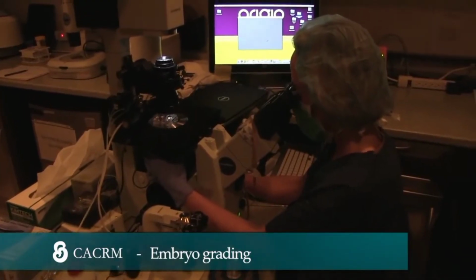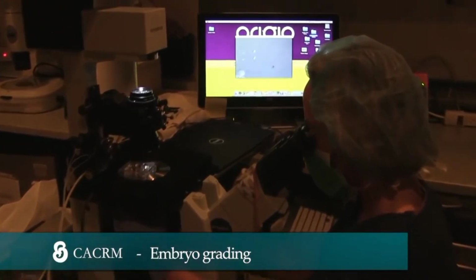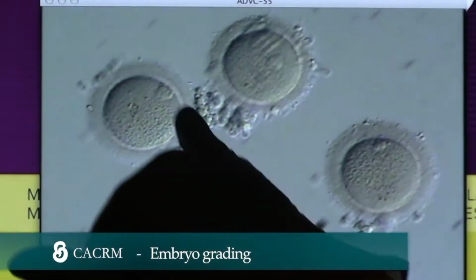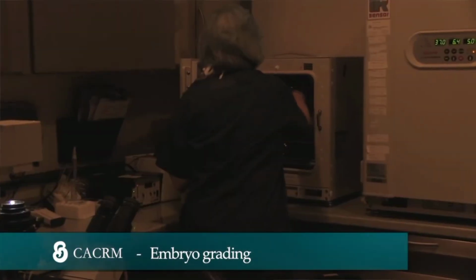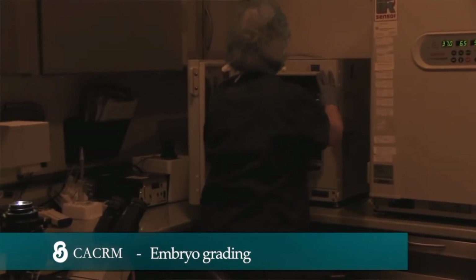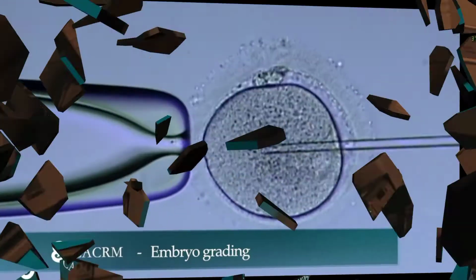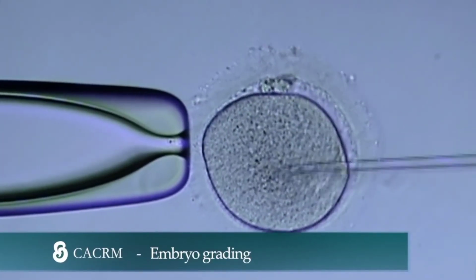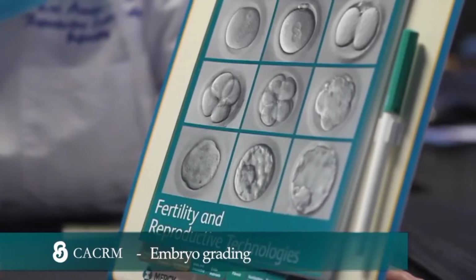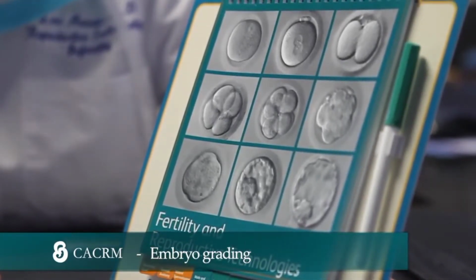The embryologist looks under the microscope at the maturity of the egg at the time of egg retrieval. The eggs are then incubated for 4 to 6 hours before the process of ICSI is done. ICSI is selecting 1 sperm to inject into 1 egg for the process of fertilization.